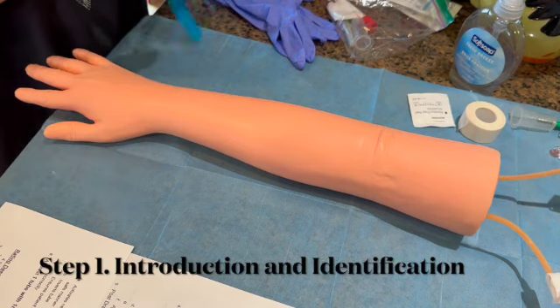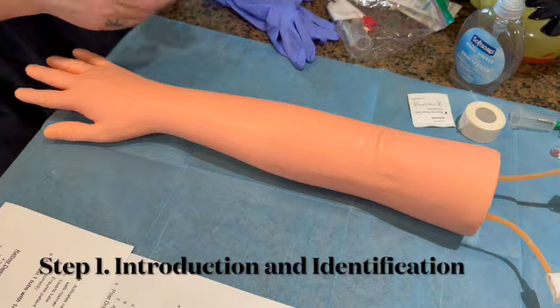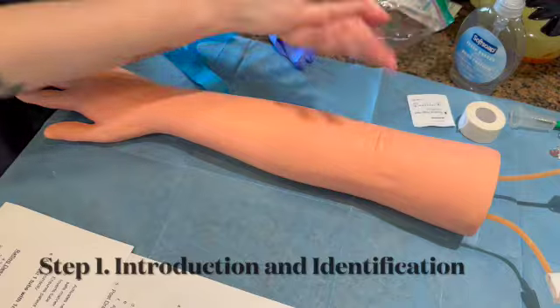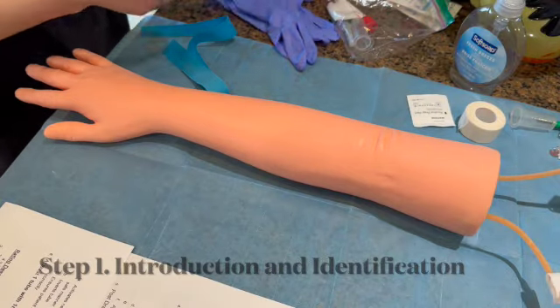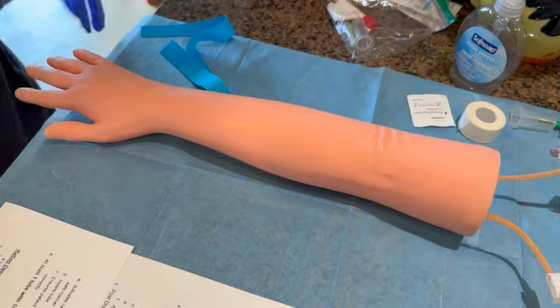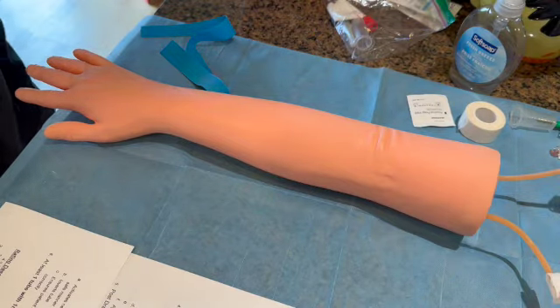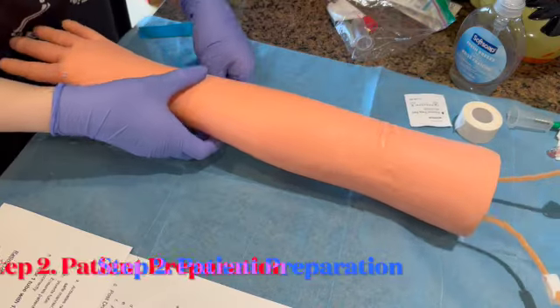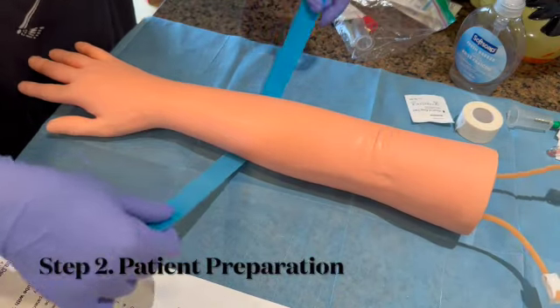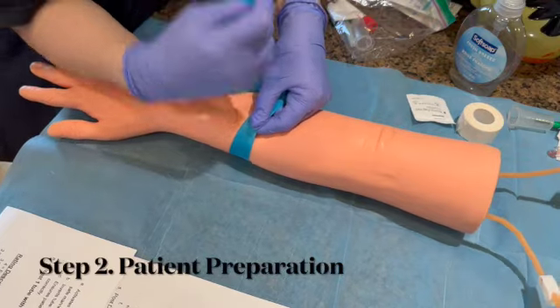And this is Robert Thing Thornton, birthday, we'll just use a random one, 4/12/62. And we're going to then cleanse our hands and we are going to don our gloves. And we are going to choose a site to draw from our patient, applying the tourniquet here as best we can again, in the appropriate location.